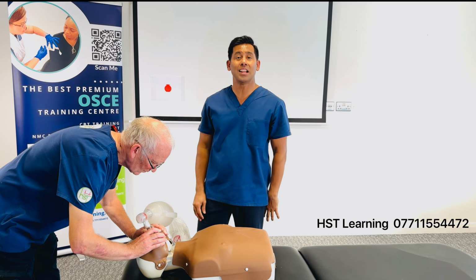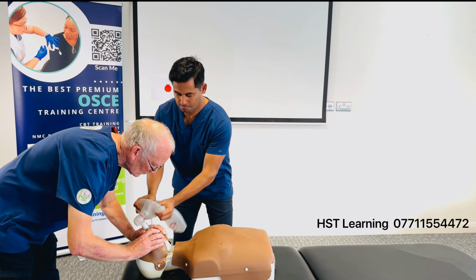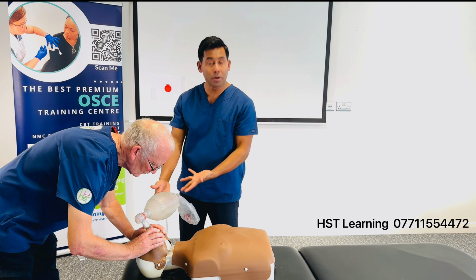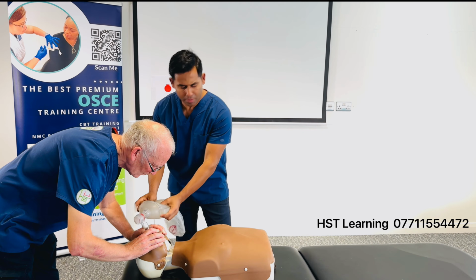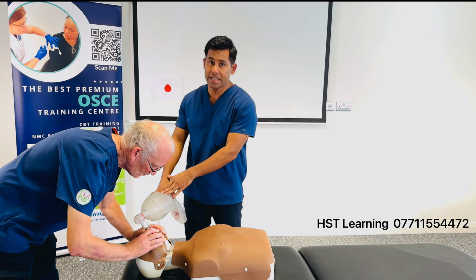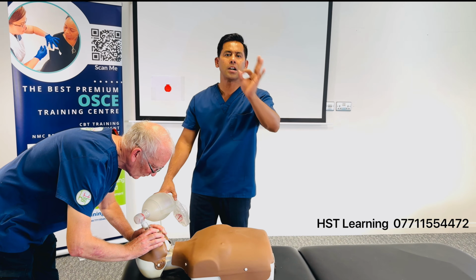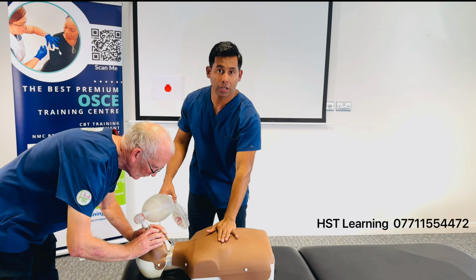How do you give ventilation? Now, some people do ventilation like this. What's going to happen here? I squeeze the whole bag, and this bag is about 1.5 to 2 liters. Do I need 1.5 liters here? You need only 500 ml. That's the capacity you need for the lungs.